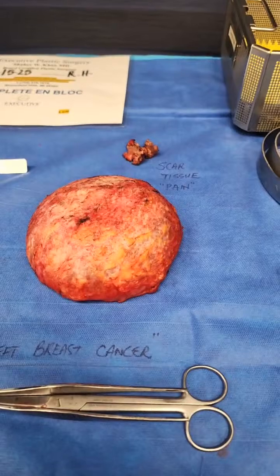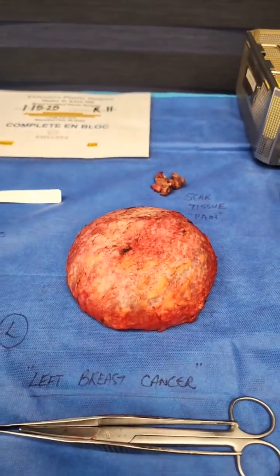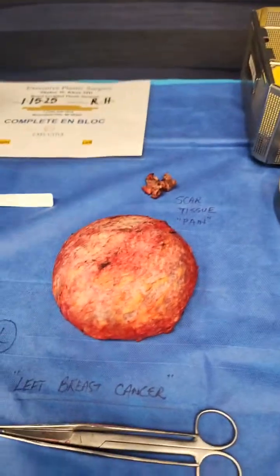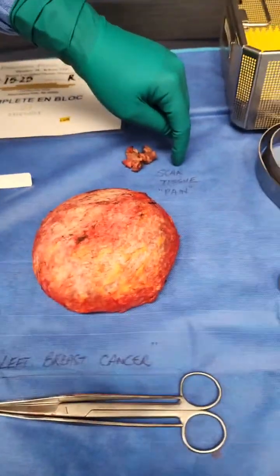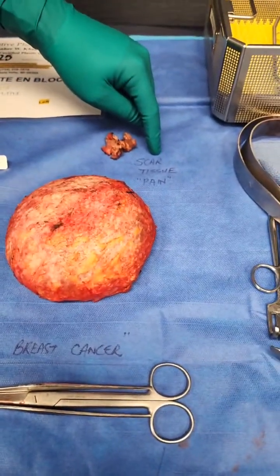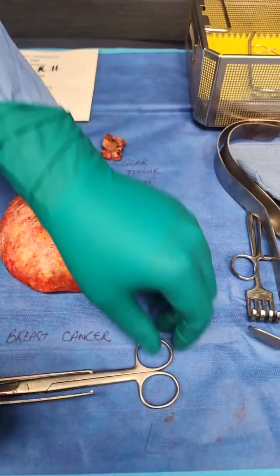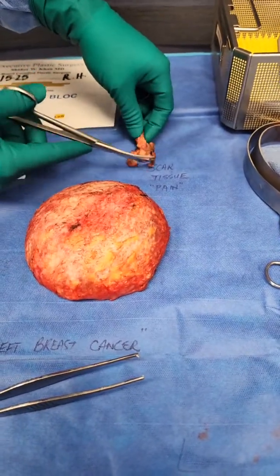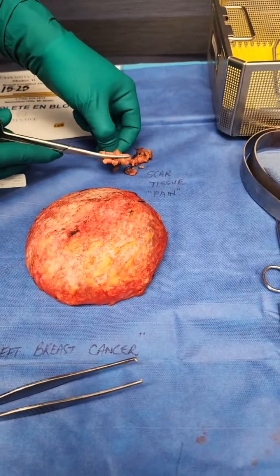Now the left side, we will see. Now what's interesting is there is no mastectomy flap, because this was a tension-free closure. The skin came together very well. She had good quality skin. She had a lot of scar tissue on the left lateral underneath the armpit that I removed. This was certainly abnormal. If you look at it, it's thickened. You can see how it looks. As I cut through it, you will be able to get a good understanding as to what it is.